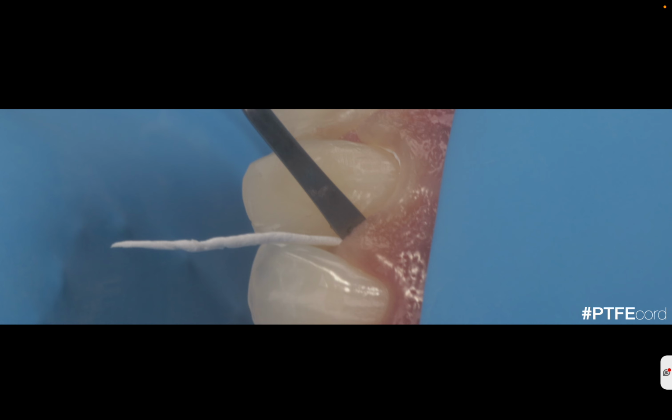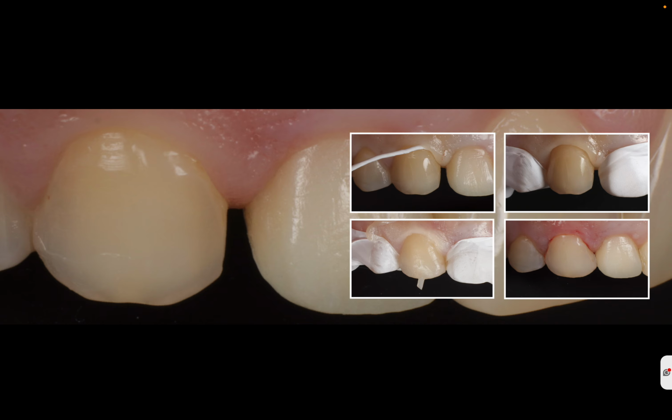Why? Just to avoid the saliva and the crevicular fluids going to the tooth. We can maintain that with the cord. And if you then do the polishing and touch the Teflon, nothing happens. So in that case we just place a Teflon cord inside the sulcus, do the injection technique, and then we repolish that.